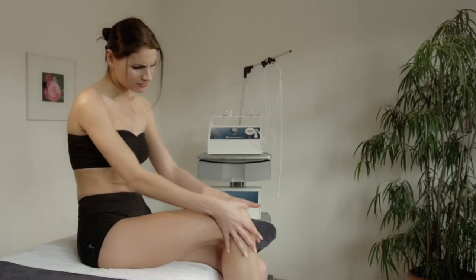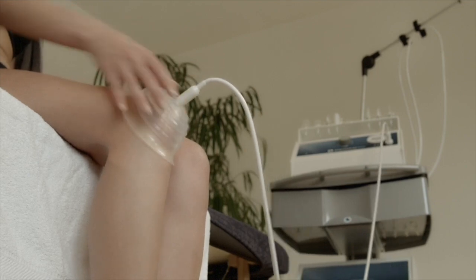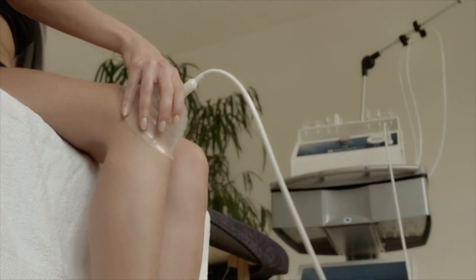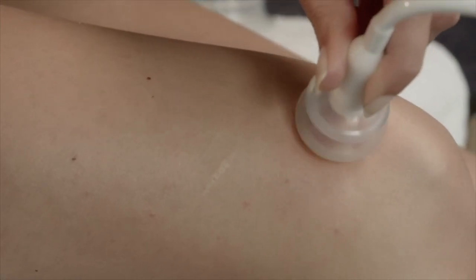For problems in the knee joint, such as osteoarthritis or so-called runner's knee, for example, the 13 cm silicone cups can be applied directly to the joint. Turn the intensity up a bit first until the two cups have become sucked in, and then reduce again until it is comfortable for the patient. Sit the patient up slightly and instruct him or her to move his or her leg slightly. The joint is once again supplied with nutrients and ligaments and tendons are slightly stretched. Afterwards, we recommend treating the surrounding muscles with a smaller cup as well. A duration of about 5 to 10 minutes in total is often sufficient.